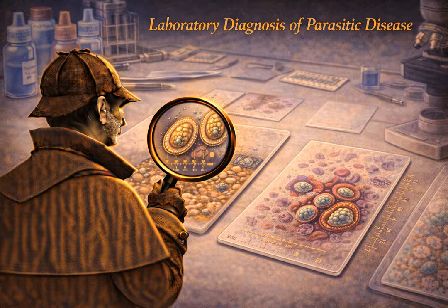What is step 3? Step 3 is the permanent stain. I like to call this the mugshot. This step is absolutely non-negotiable for identifying protozoa. We typically use stains like trichrome or iron hematoxylin. Why is this final step so essential? I mean, couldn't we just identify them from that concentrated iodine wet mount?